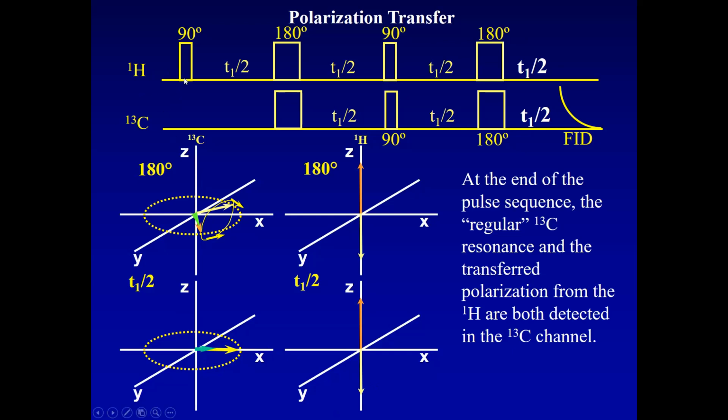So in this sequence, the first thing we do is we set this up with a 90-degree pulse to protons, so that the carbon-13 influence has a chance to make itself known during this time delay. We bring 180-degree pulses in here so that the dephasing can move to opposite and really reach full antiphase magnetization. Then the rest of this is designed to, the 90s, transfer the polarization from protons to carbon-13, and the rest of the sequence is designed to bring the carbon-13 into phase coherence.